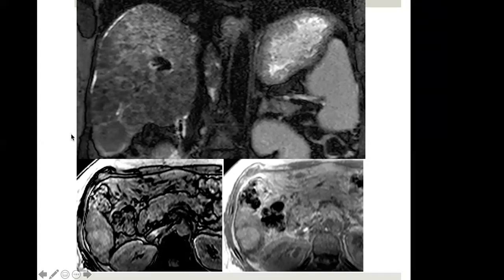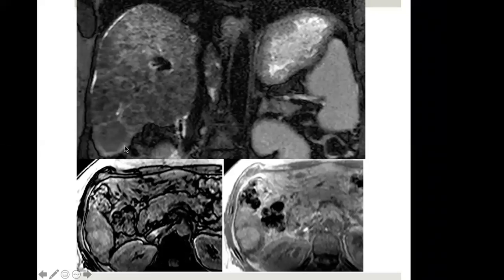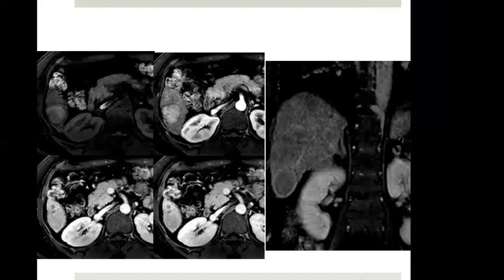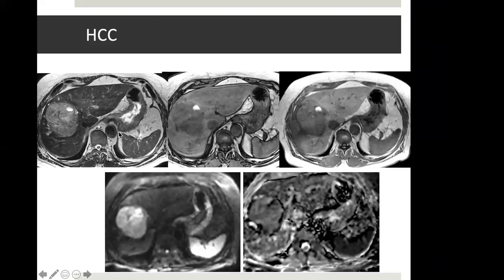Here is a garden variety low-grade HCC: a very well-defined nodule in the liver, slightly exophytic, arising from the segment 5-6 junction. It is hyperintense on T1. On the opposed-phase image with the India ink effect, there is a subtle signal drop in the center of the lesion — a small amount of intratumoral fat. On T2 this is dark in signal, preserving the signal of a regenerative nodule, but it is much bigger in size. On contrast-enhanced images, there is non-rim-like arterial phase enhancement, non-peripheral washout on delayed phases, and capsular enhancement — a classical low-grade HCC.